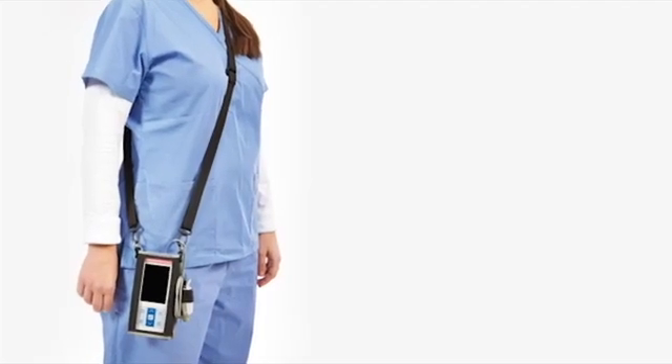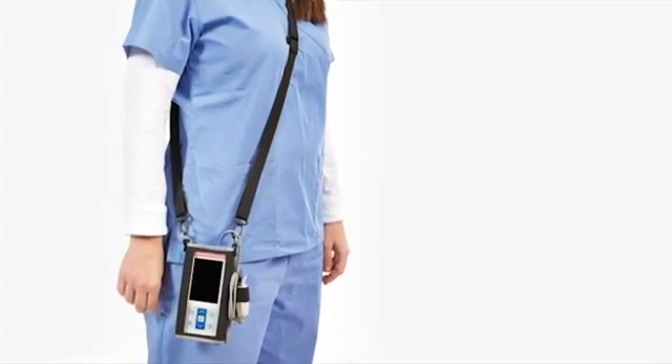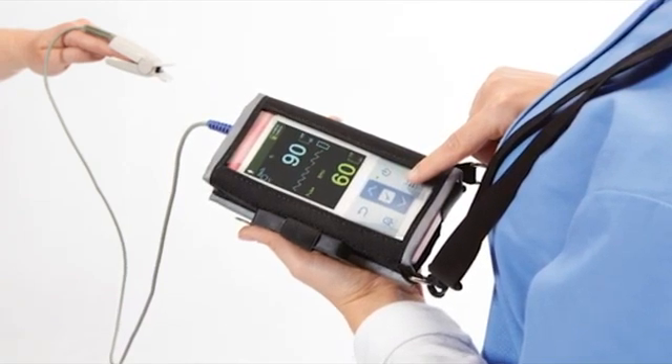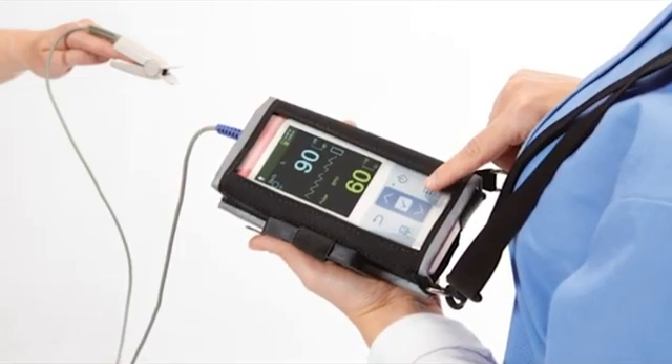The monitor incorporates Nellcor digital signal processing technology to deliver accurate, reliable SpO2 and pulse rate values, even during low perfusion and signal interference, including patient motion.